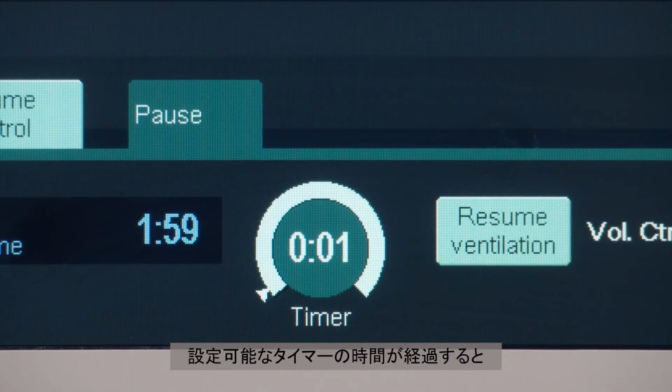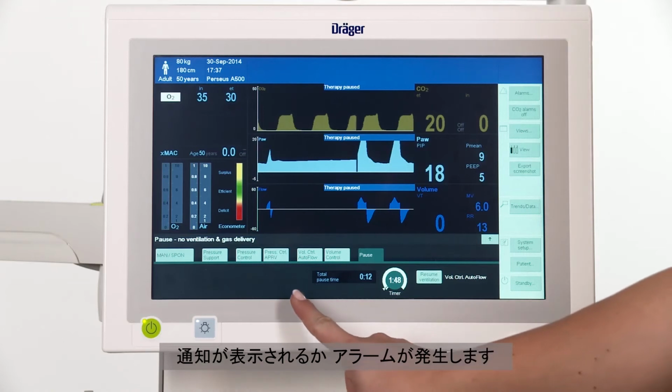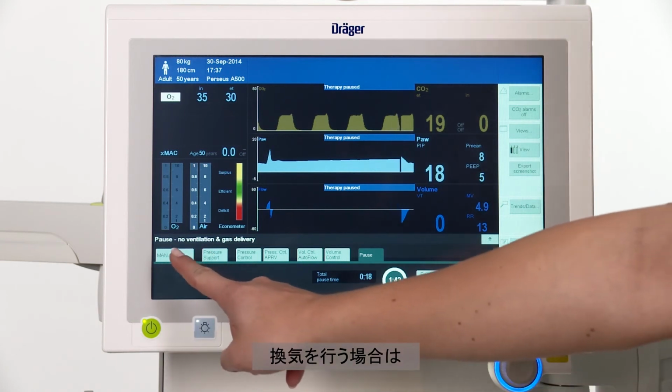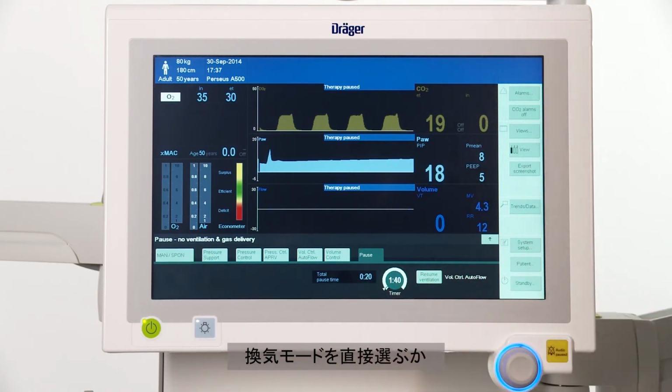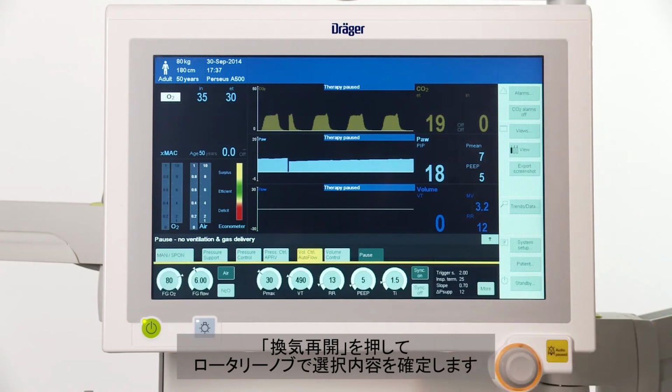After the configurable timer has elapsed, Perseus will issue a notification or an alarm. In addition, the total pause time is continuously displayed. If you wish to continue ventilation, either select a ventilation mode or press Resume Ventilation and confirm your choice with the rotary knob.